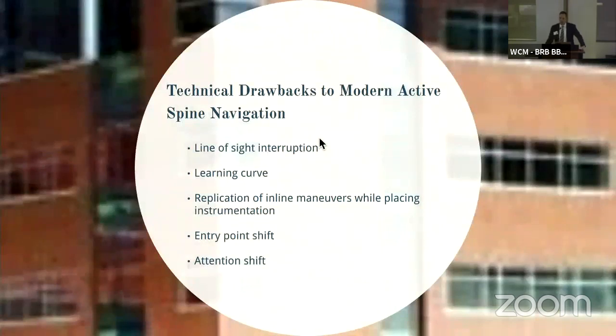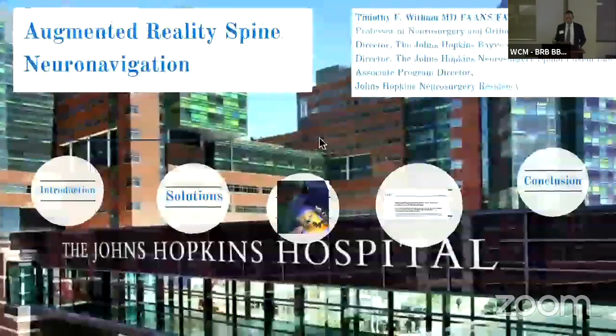Line of sight interruption. If you get in the way of the camera in the reference frame, that causes a disruption in your workflow and can be quite disrupting. There's a learning curve to all of these technologies. Replication of inline maneuvers when placing instrumentation is very important. We saw that in the last talk. Entry point shift, skiving, and then attention shift. We're looking away from the patient. Attention shift has been shown to affect cognitive and technical abilities in psychological studies.